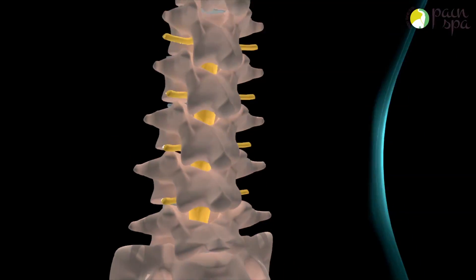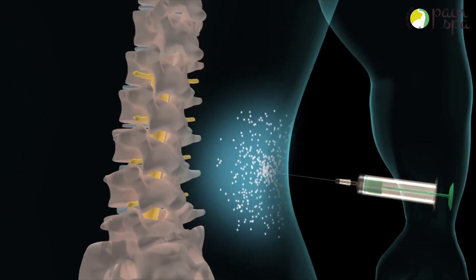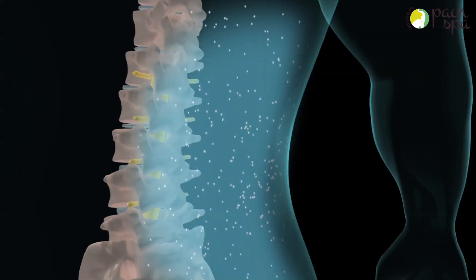The procedure is done under local anesthetic. Dr. Krishna will initially numb the skin and deeper tissues with a numbing medicine.